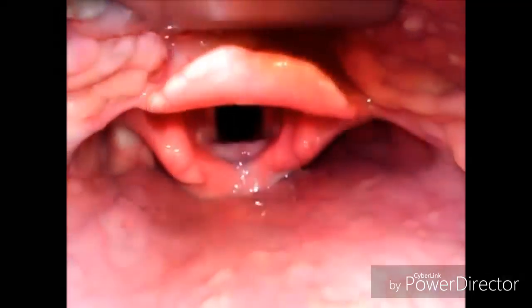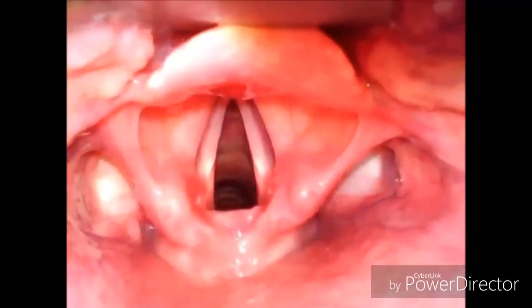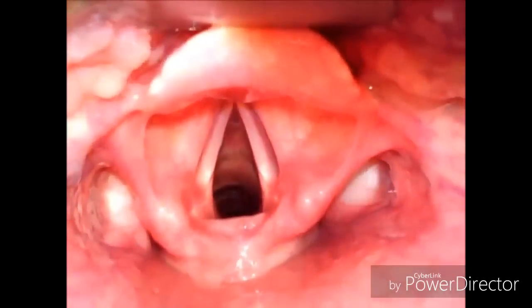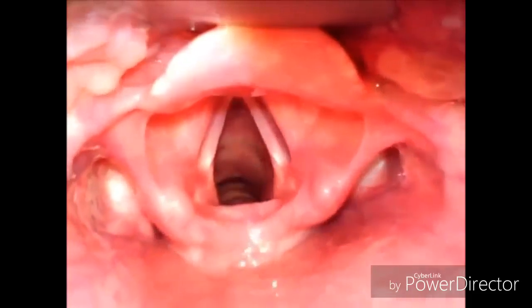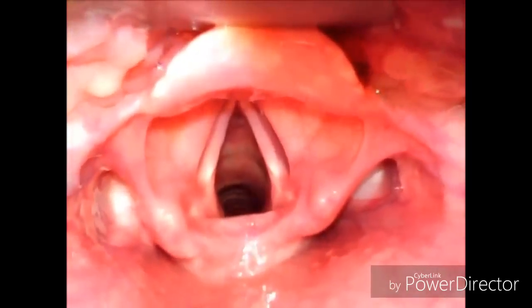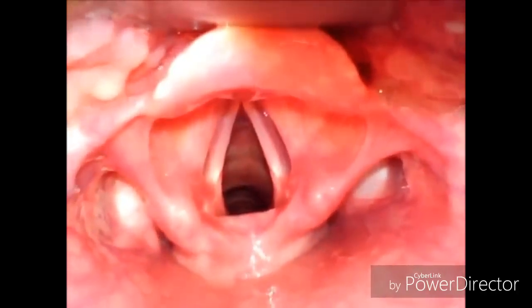As soon as you lift the epiglottis, you can see there is an opening for the trachea. This opening is characterized by the presence of vocal cords, which are placed laterally, and in this opening you are supposed to introduce the endotracheal tube. Unless and until this opening is visible, you are not supposed to introduce the endotracheal tube.